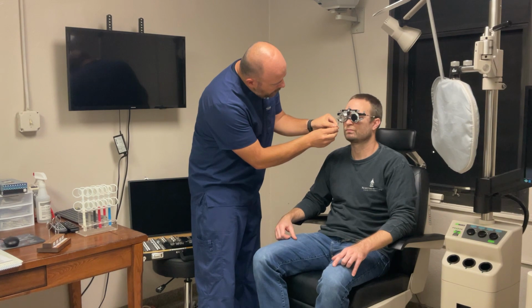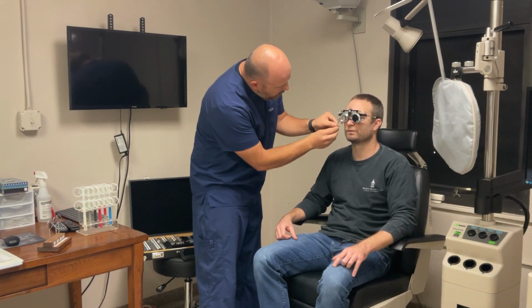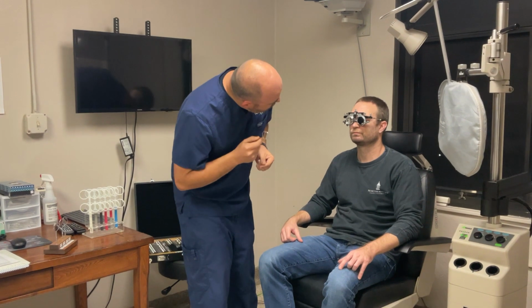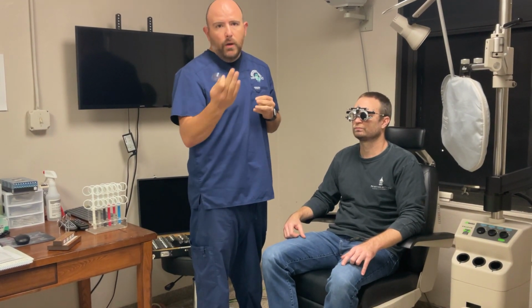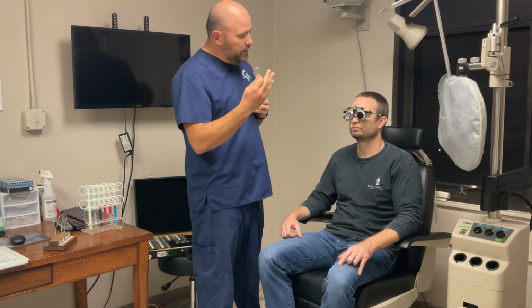1 or 2, or no difference. Here's 1. Yeah, they're really similar. There's 2. Okay. Yeah. So the patient has noticed neutrality at around 70 degrees. So I know that on the lesser degree side, so say less than 70, we know we don't want to be over there. He's happy at 70. We've already covered from about 40 to 70.